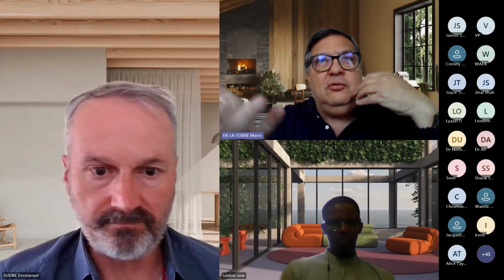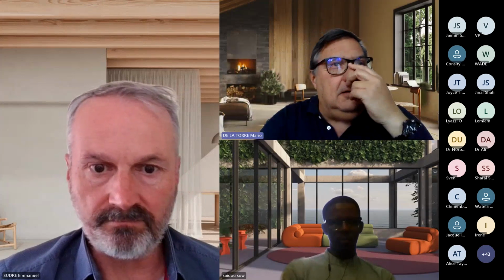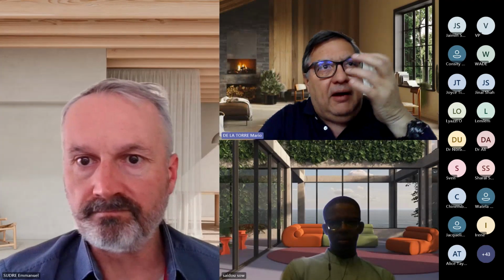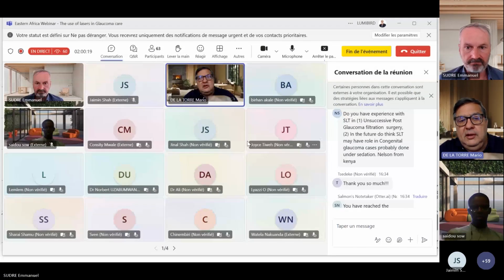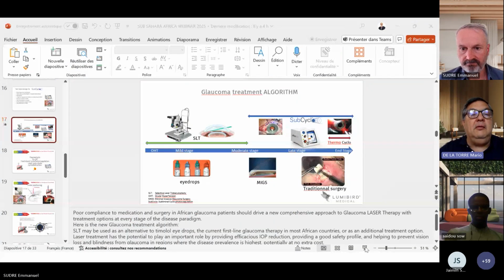Normally, if I have a filtration surgery, that means I have escalated, and then I don't go back. If I am in the situation that I should do a filtration surgery, that means I am at the extreme. I am going step by step.